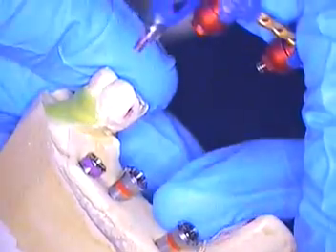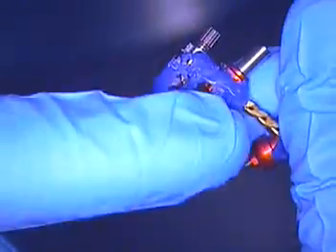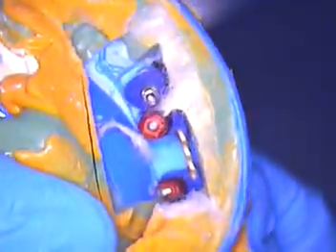Here we see the tissue level analogs and tissue level impression copings in the bicuspid region, and this is the newer bone level implant placed a little further posterior in this case. Now, just to show you — this is where I cut out for the open tray impression copings. This is where I actually took a scalpel and dug it out of the impression. And this is the material that I dug out of there.